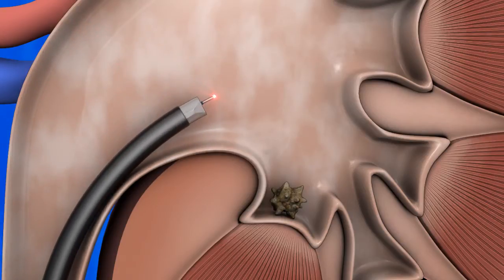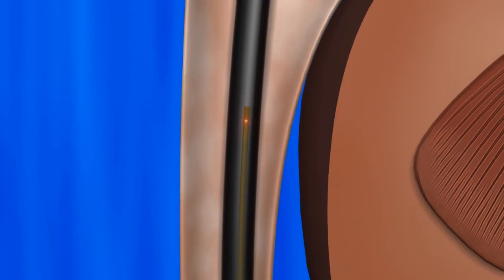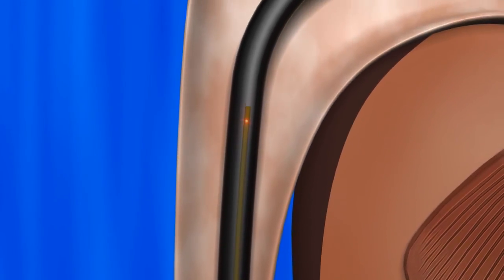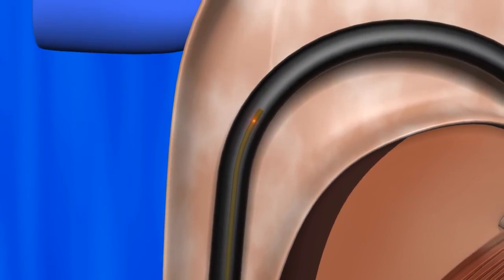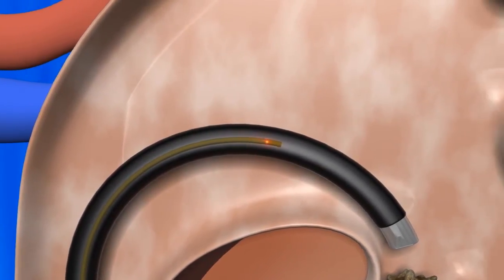The good news is there is a solution. The EOS multi-pass sheath enables the operator to advance the fiber multiple times through a deflected scope, eliminating the need to straighten the scope prior to fiber advancement, leading to improved procedural efficiency and saving valuable OR time.